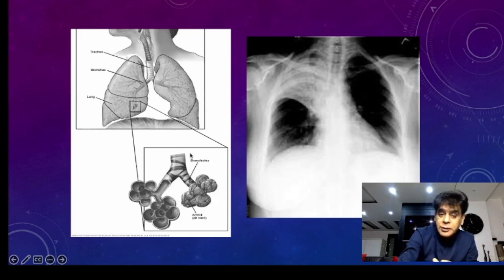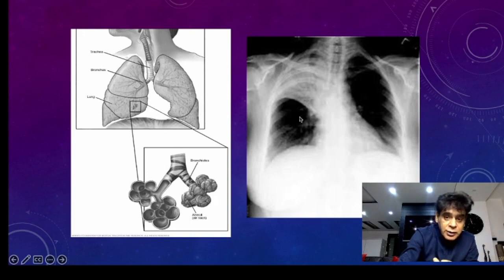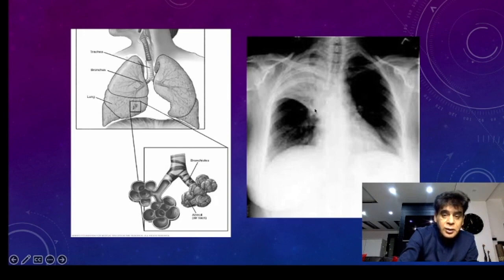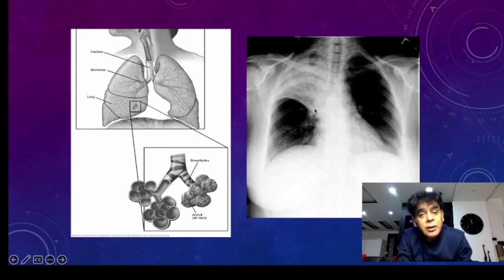What happens when the alveoli become bright? Whenever they become bright, there is a chance of seeing the bronchi. You can see in this case there is a bright patch, and here you can see the dark areas of bronchi within the lung. This is known as an air bronchogram.